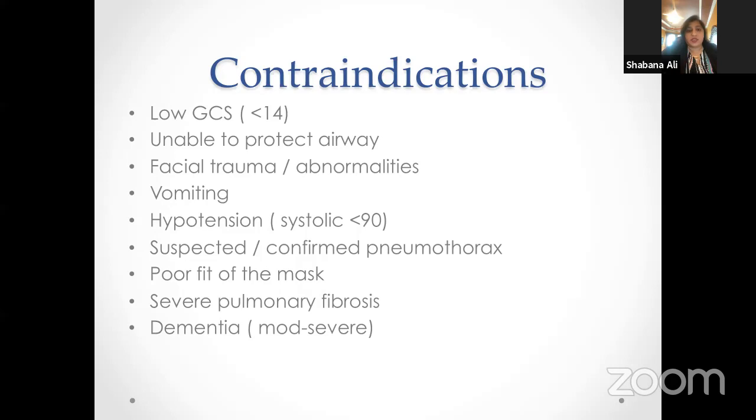Of course, if the patient is not breathing and you think the patient is going to be more and more drowsy and is not taking over the function of breathing, then CPAP is not a good option. If the patient is not able to protect the airway and it is getting obstructed, again, CPAP is not the way, because as we mentioned, in CPAP the patient has to initiate the breathing on their own. If there is any facial trauma or abnormalities, you cannot put the mask on the face, so it's not a good option for the patient.